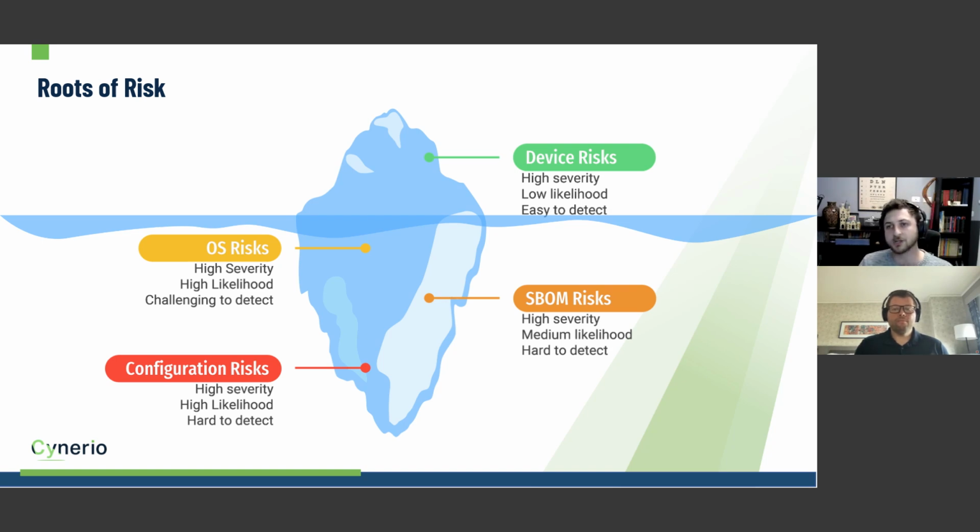The challenge here is partially a detection challenge, right? It's not always so straightforward to know what kind of operating system a specific radiological device or an IV pump is running. But primarily the challenge here is actually, what do I do about it, right? Because a lot of times these operating systems are not easily upgradable. There's either a service contract with the manufacturer, or there are all kinds of other complications. It's not an easy thing to just upgrade the Windows version, right?